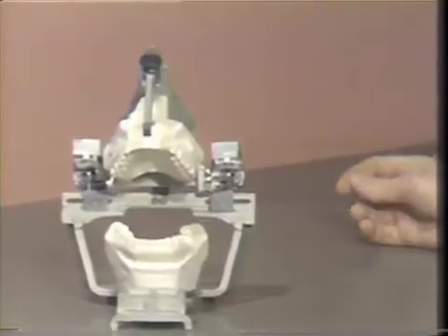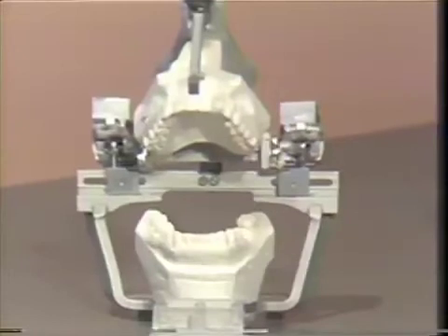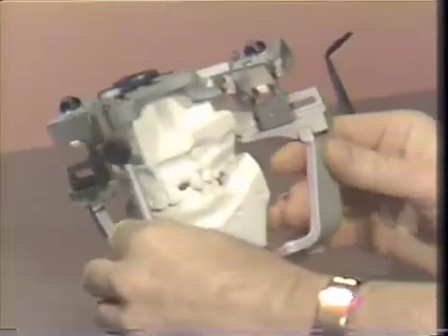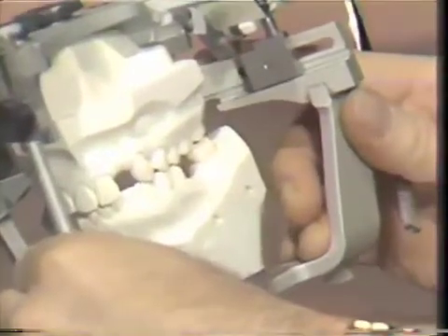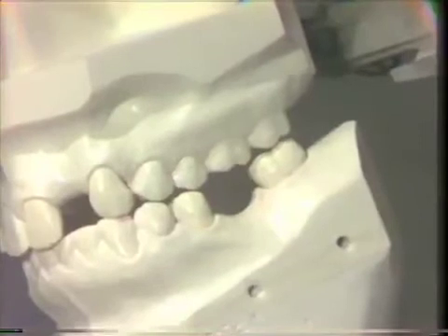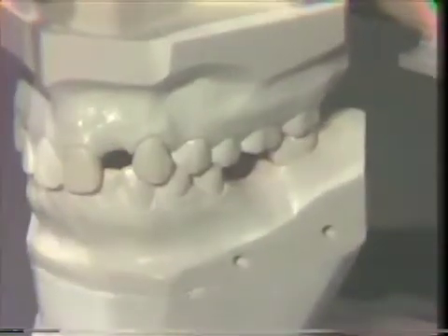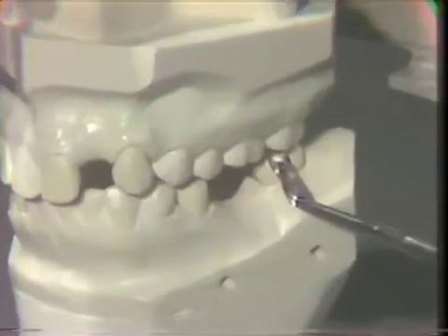For our laboratory demonstration, we have elected to do a lower posterior 3-unit bridge. We will consider this our patient, and our patient's dentition has been stabilized. You will note that we do have cuspid guidance that discludes the posterior dentition. Before we start our preparations, we will ascertain that we do have a positive contact on the areas that we are going to prepare and also on the opposite side of the mouth.